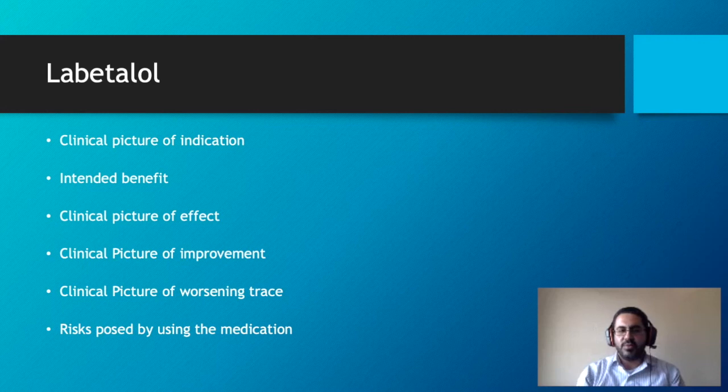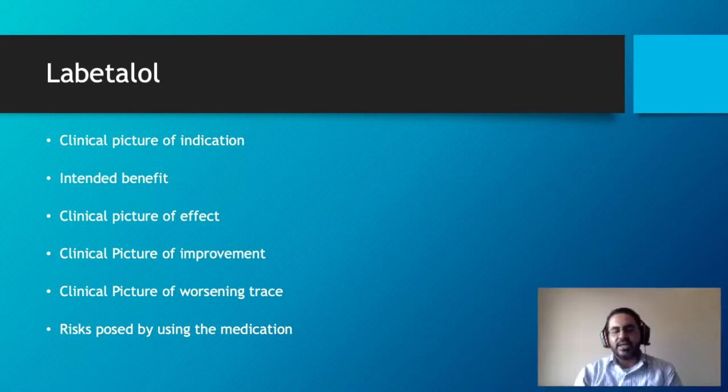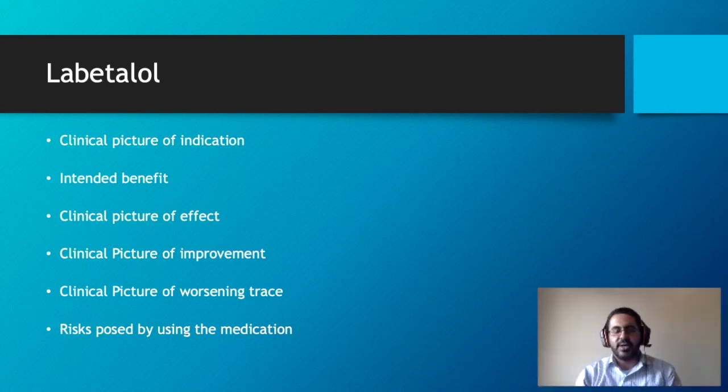Now, the problem with this baby is that as the hypoxia becomes worse or progresses, what's supposed to happen to this baby's trace? We're going to start off with a normal trace and then start some cord compression, so some decelerations on the trace. And as it's getting worse and worse, the next step is that the baseline should be going up. Is that correct? Yeah. That's the sign of compensation. That's adrenaline release. Now, is this baby's baseline going to go up? No, not as much. It's like trying to go for a jog on a beta blocker. Precisely. So it can't raise its heart rate. Can it actually redistribute?